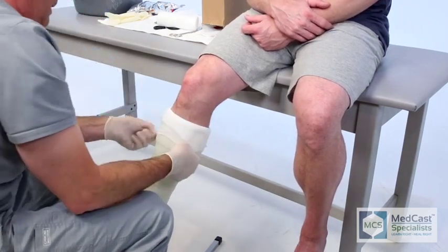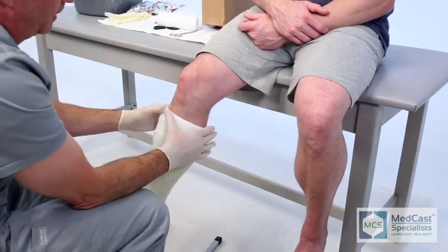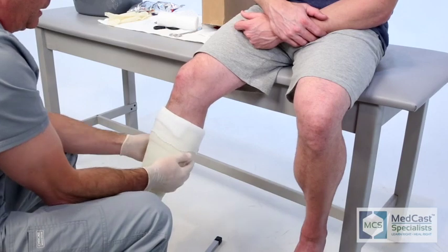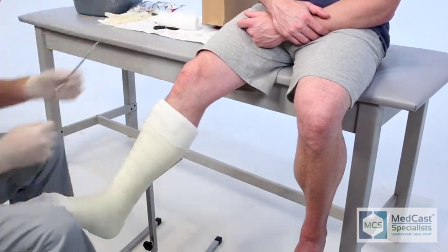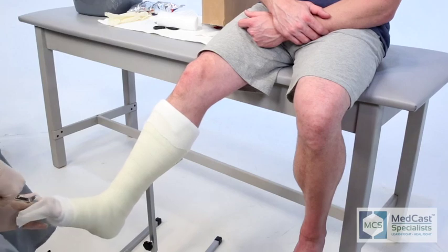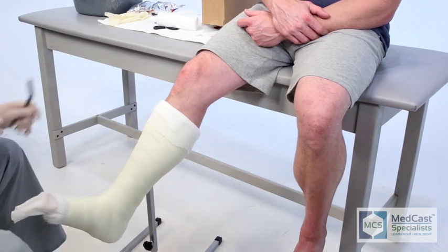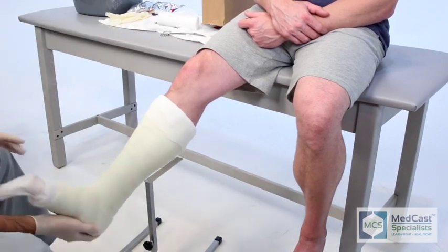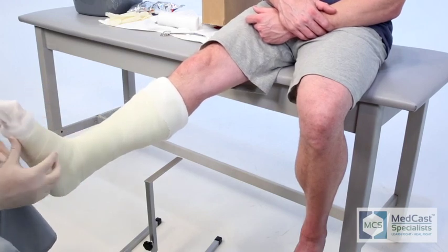You can tell right there on that anterior aspect how much padding he's got — that is perfect. That's again the prominent area, whether they're going to be on a scooter or resting it down. If they're lying in bed, that cast is going to be heavy and it's going to pull down on there. That anterior aspect of the tibial spine — there's nothing covering that bone except for skin; there's no fat tissue, no muscle. It's very prominent, so make sure you have that part padded well.